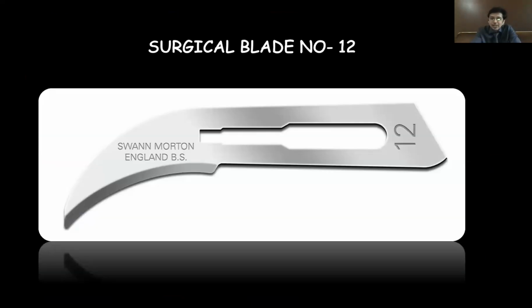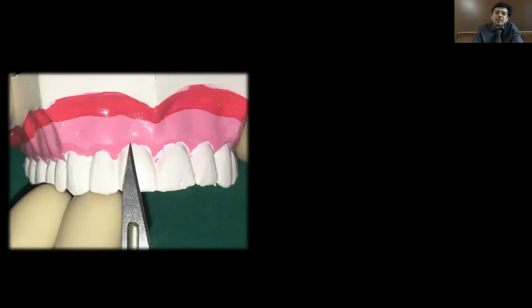This is a blade which many of us don't use. The majority of us, as practitioners, use a normal 15 number blade for all surgeries. Ideally, for an incision in the posterior area, a 12 number blade should be used. The reason for that is very simple.